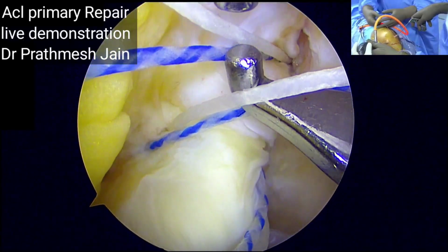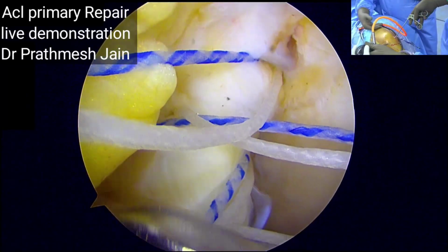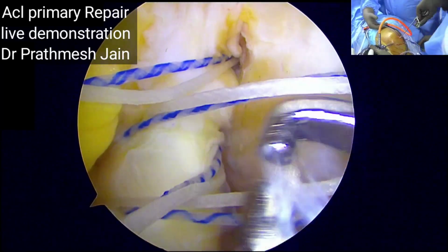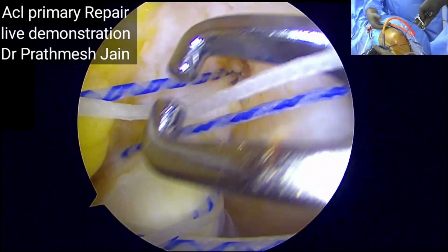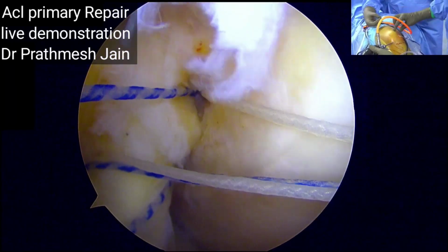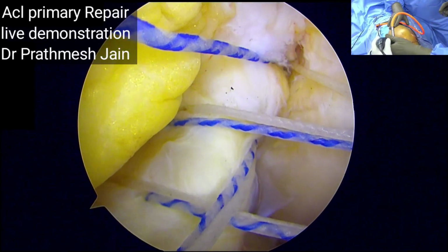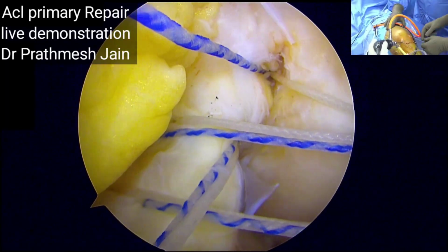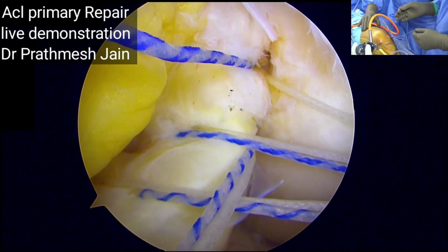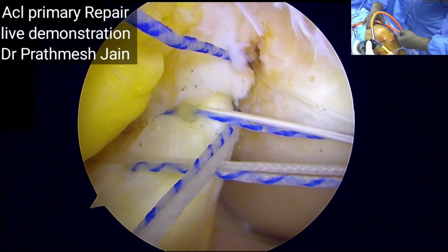At this point of time I would be starting to repair my ACL in this fashion. Okay, just leave it. Okay, so this is my first suture limb. Hold my camera like this. Okay, so here you should understand the arrangement. My knee is about 30 degrees of flexion. I would want my knot to be on my ACL stump, so I'll just pull the other wire around.